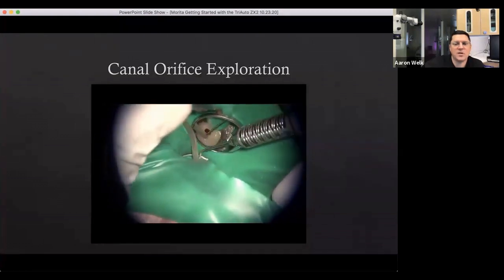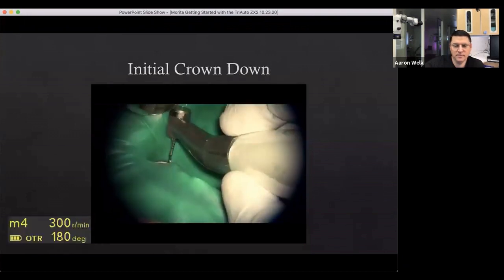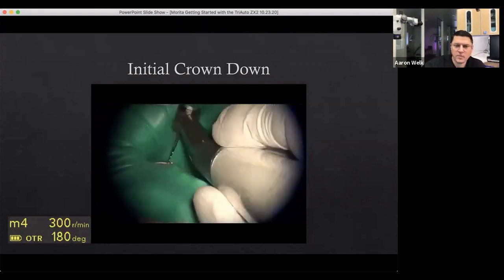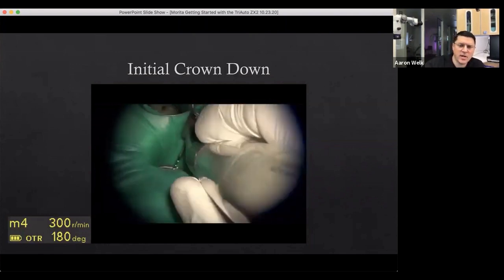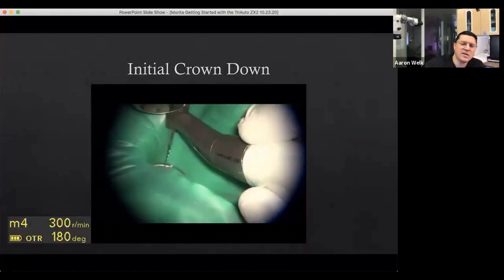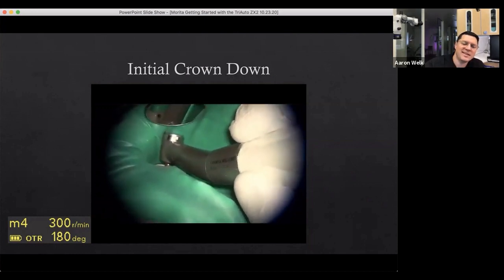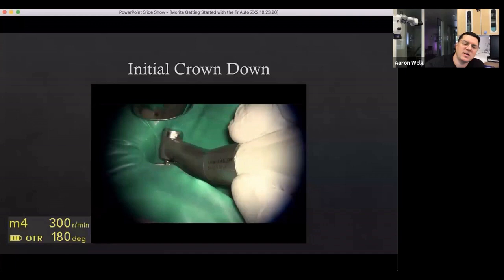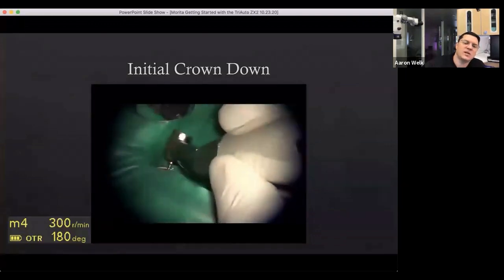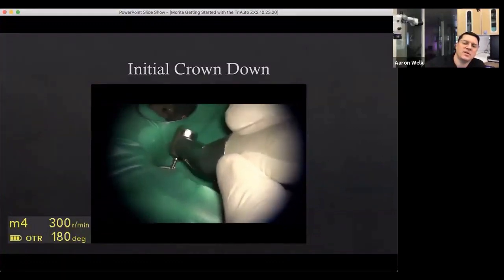Once the canal is located, we use an explorer to identify it — you can see there's a lot of bleeding inside the canal space. We're going to do an initial crown down using the M4 setting. I'm using an S1 file, feeling for the pathway before I even activate. These are relatively large canals, so I didn't need any glide path preparation. This is mainly showing the OTR function in terms of sequencing.